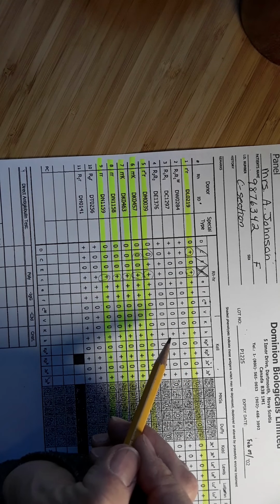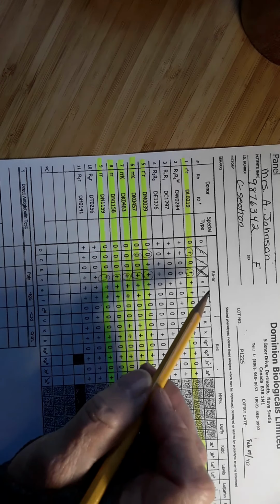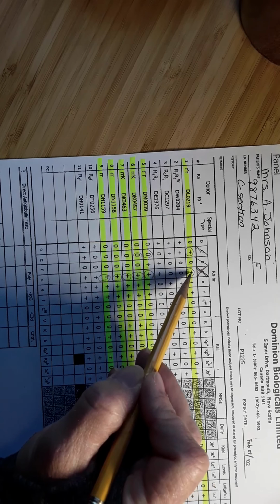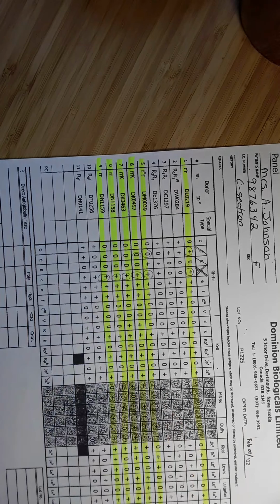And it says in step 3 on page 9, Roman numeral 1, if 2 homozygous cells are not available, at least 1 homozygous cell and 1 heterozygous cell may be used to eliminate these antibodies. But we've managed to eliminate anti-little c based on non-reactivity of the patient's plasma with at least 2 homozygous cells. We've actually got 5. Okay, so that's the idea.